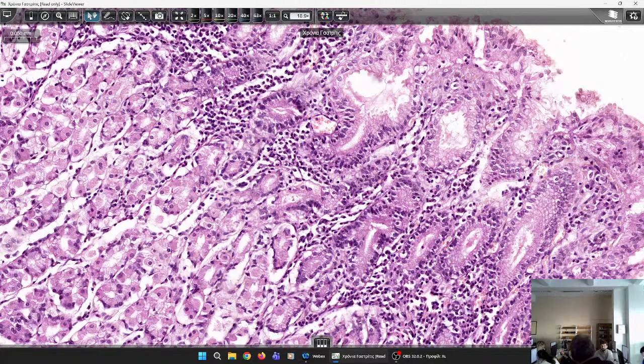So in acute gastritis, we just have an erosion of the superficial mucosa and not necessarily an increased number of neutrophils. If we see neutrophils in the gastric mucosa, it is more commonly in the context of a chronic gastritis with activity. So the neutrophils denote the activity of a chronic gastritis.